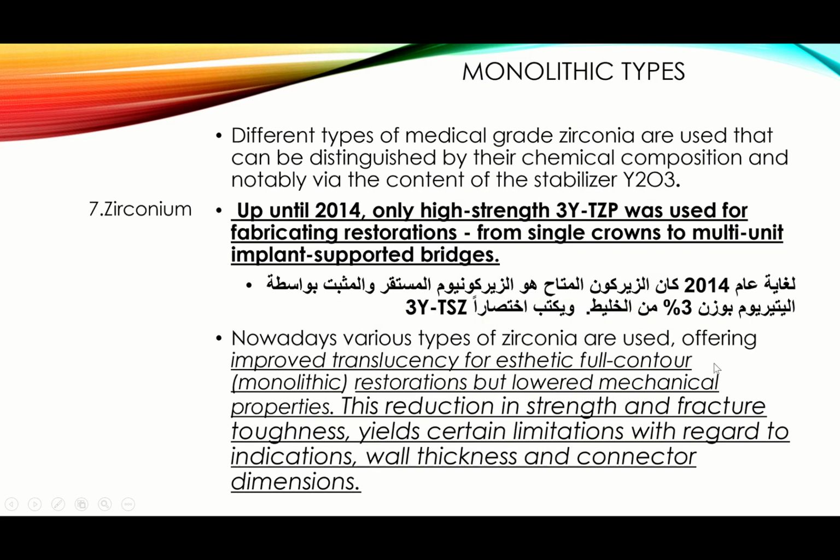Now, up until 2014, only high-strength 3-yttrium tetragonal stabilized zirconia was used for fabricating restorations, from single crowns to multi-unit implant-supported bridges. Of course, it was used as a core, and then we veneer or layer or stack. We build up on top of that core.